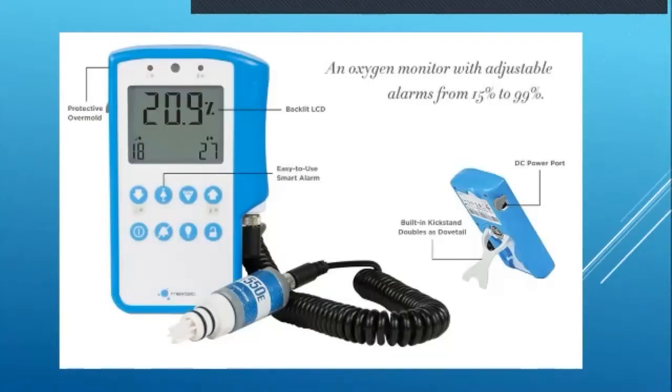All right, so here we go. This is one type here. This is just a picture of an analyzer. You see this little part here? This is where you would put it inside the flow.